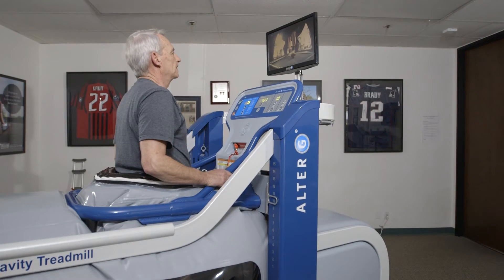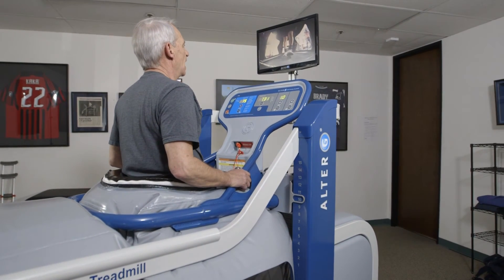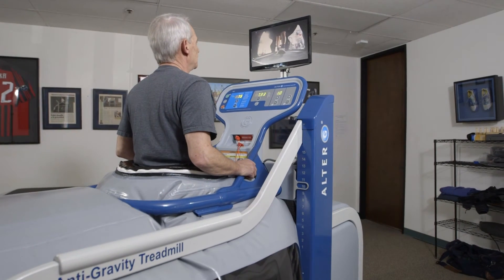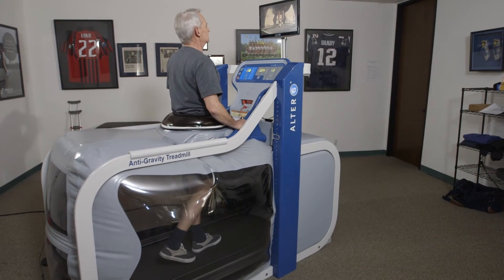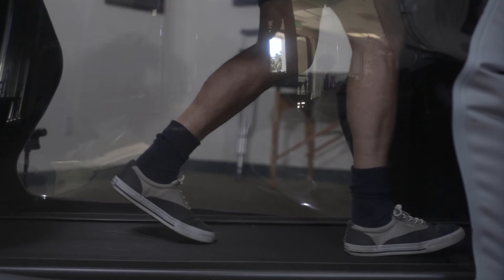Closed-chain exercises should be progressed to overground. Patients should continue gait training on the AlterG with focus now on equalizing step length, stance time, and cadence. Use the reverse mode to emphasize active open-chain knee flexion and closed-chain knee extension for propulsion.